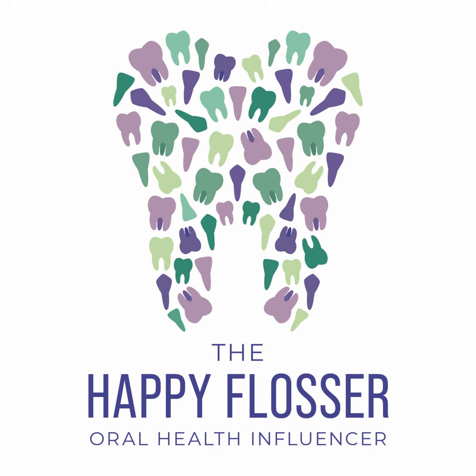And then some other things that show up on radiographs, like a ground glass pattern, like I said, those are characteristic of several diseases. So when you see that ground glass appearance, it's important for you to investigate and take note, because that patient may have something like hyperparathyroidism or Paget's disease or fibrous dysplasia, and these things haven't been noted yet, or they haven't found out about it. So sometimes you might be that first person that takes a radiograph and notes some findings, and that may cause a cascading effect where that patient then sees their doctor, and we go from there.